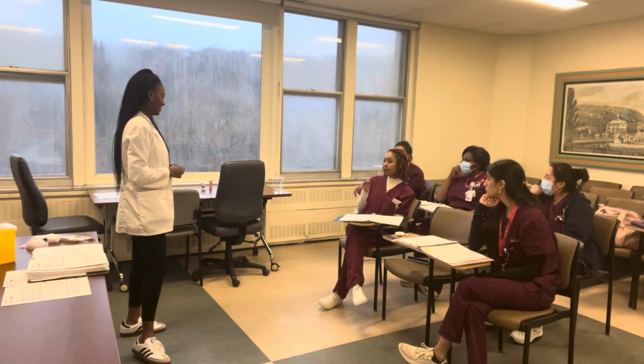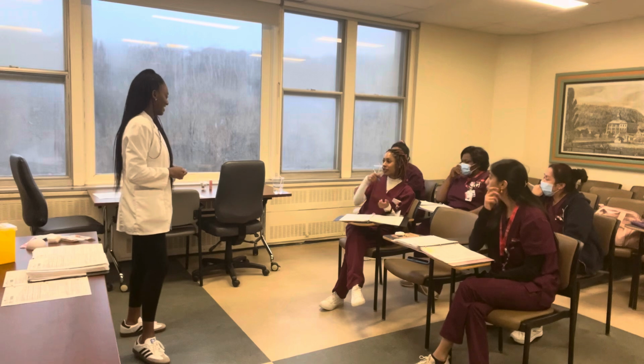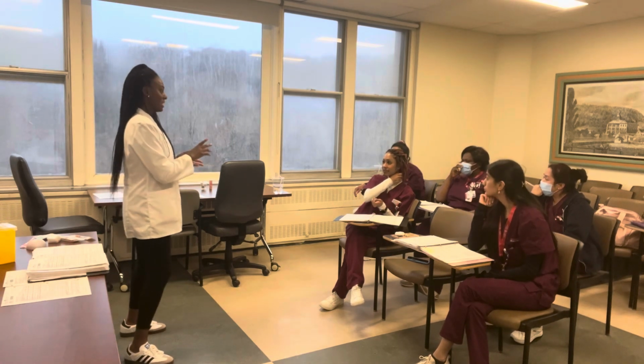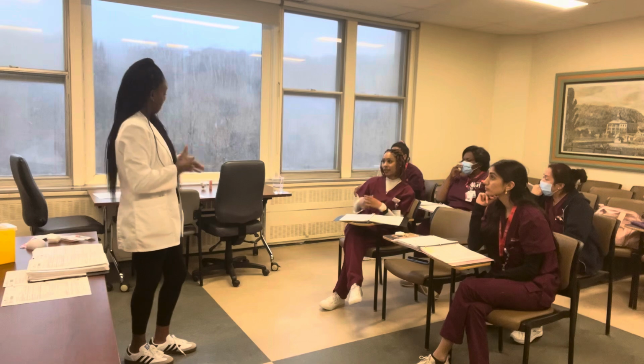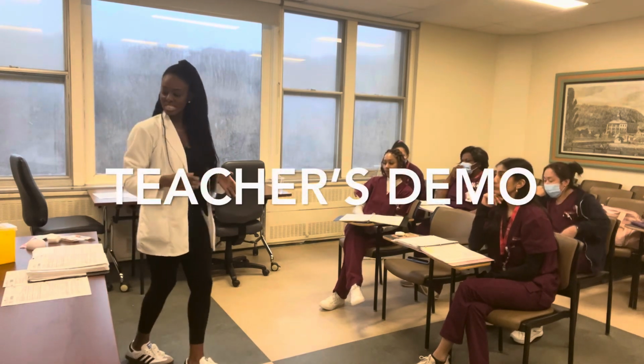But also with the pen, normally you expel 2 units, but with the injection, I almost did and I realized you don't do that with the injection. Right, because you're not attaching the syringe after, you're drawing with the syringe, so it's already inside. My brain couldn't separate that. But now that you did it, it makes sense. Okay, so we'll start with the exercise.